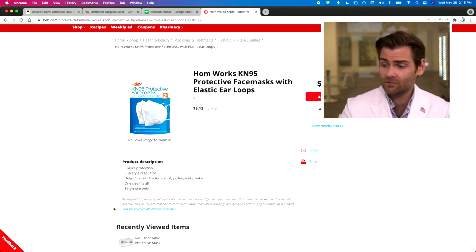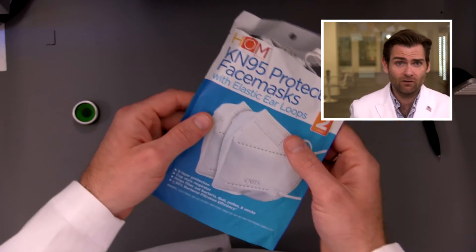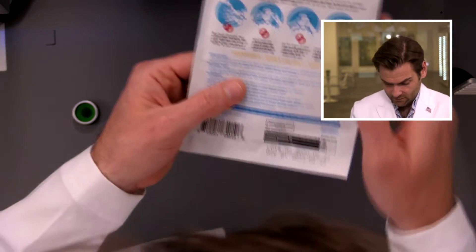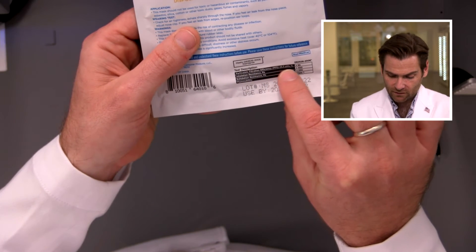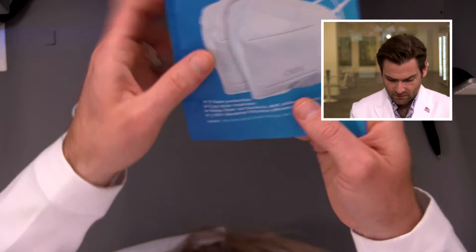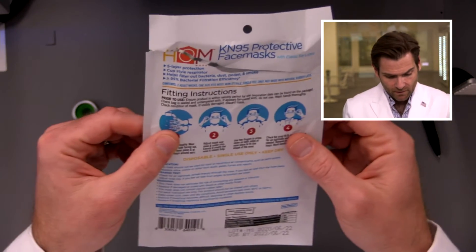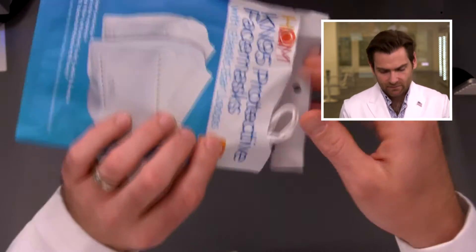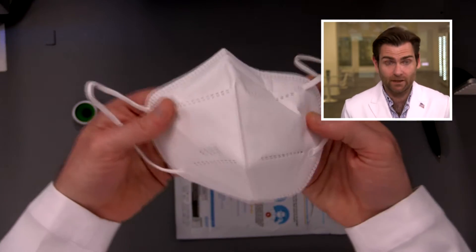Are they making any claims on here? I'm not seeing explicit claims, but you could argue that calling it a KN95 is a claim in itself, because KN95 is a Chinese format that says it meets 95% filtration. There you go — particulate filtration efficiency 95% and 95% bacterial filtration. So this should do 95% or it's not a very good mask. This is like one of those hangy bag things — I've only got one to test so I need to be careful.